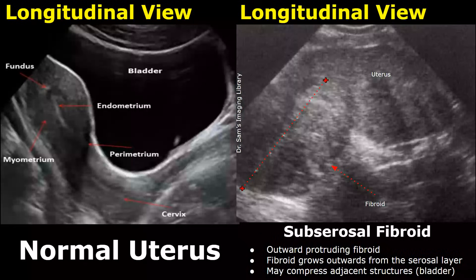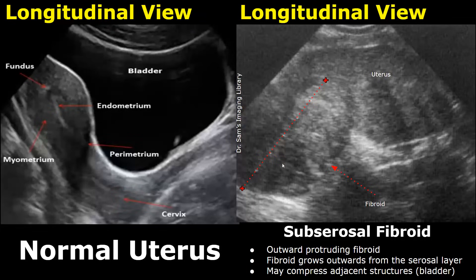Here is another image of a large subserosal fibroid. It has mixed echogenicity with some hypoechoic and hyperechoic areas, and it is growing outwards from the uterine wall. So this is a subserosal fibroid.